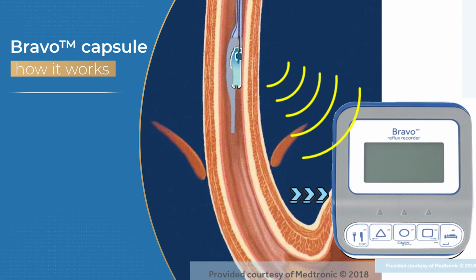You might feel a tug when food passes the capsule. This is normal. The capsule will fall off in 5 to 10 days. It leaves your body in a bowel movement and you flush it away.